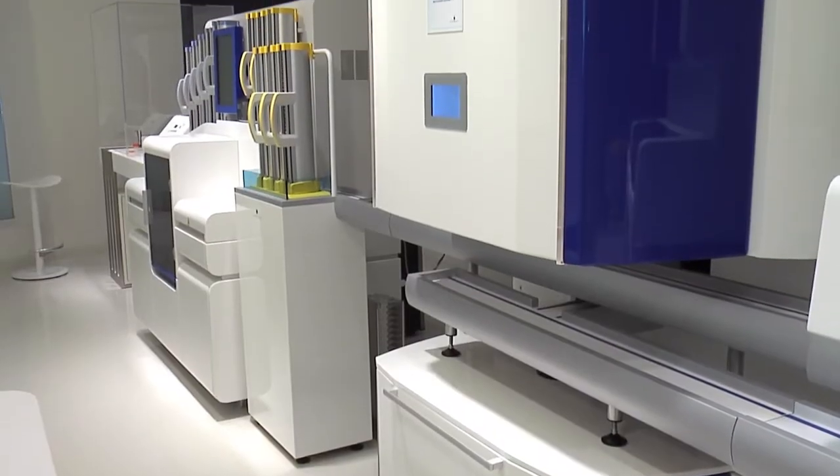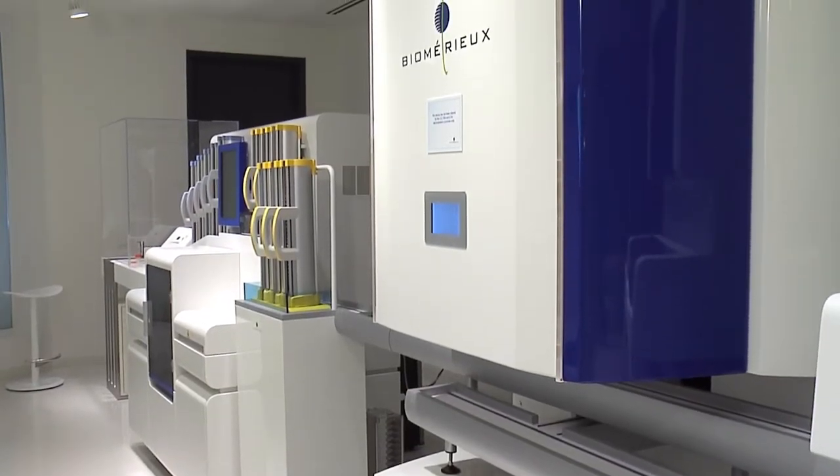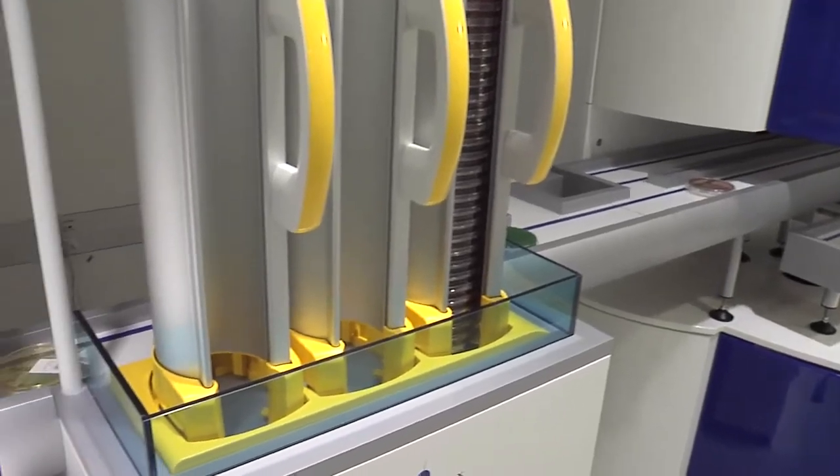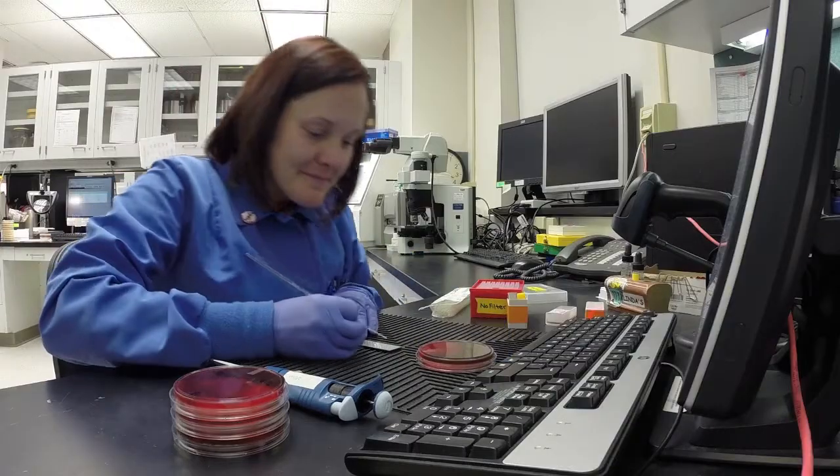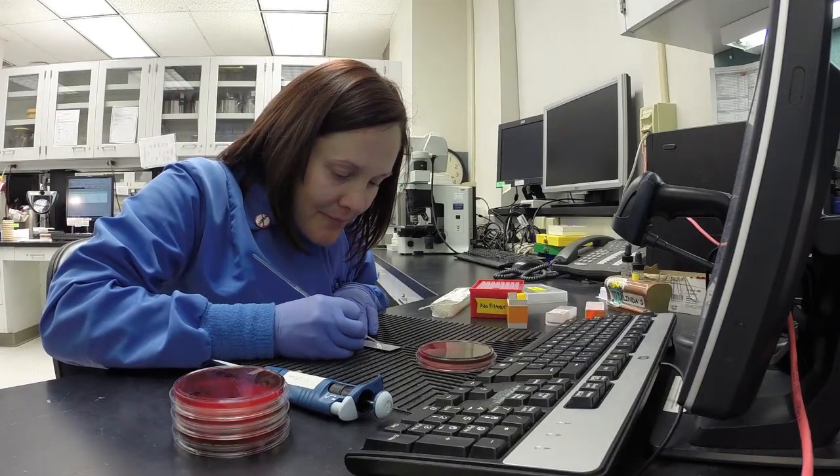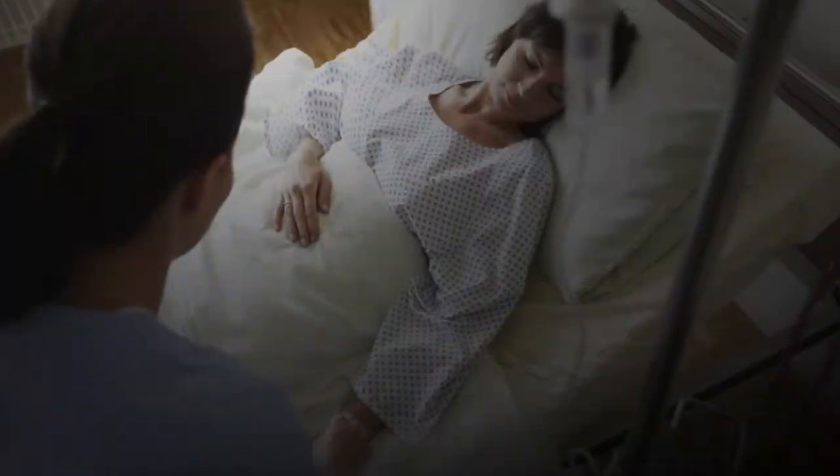With the PREVI Isola, the big gain that we had with that was the ability to process through some of the big volume samples. They're making a huge difference if they can provide this timely information for us. Clinicians love it. They know to look for results very quickly. Speeding up time to identification is great for patients.